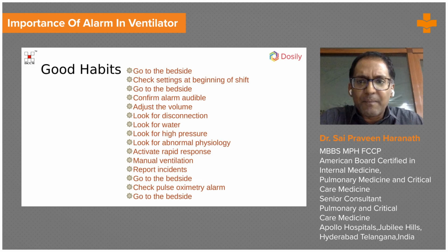In other words, if there is an alarm that you need to address, immediately call for help, because one person may not be able to do it, especially with a COVID patient. You should not go into the room unless you have protective equipment. It can be dangerous for the patient, but your life is more important. You have to make sure you do it safely.